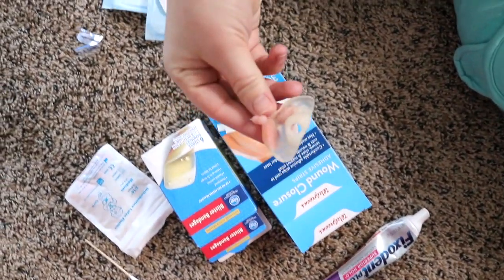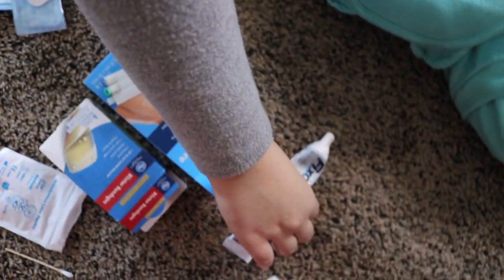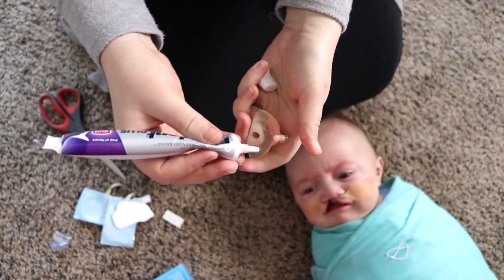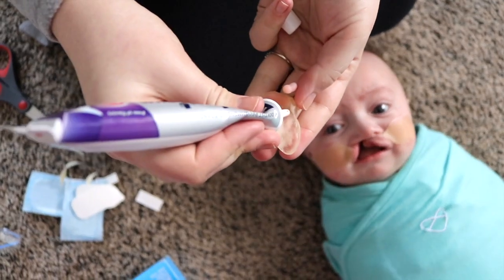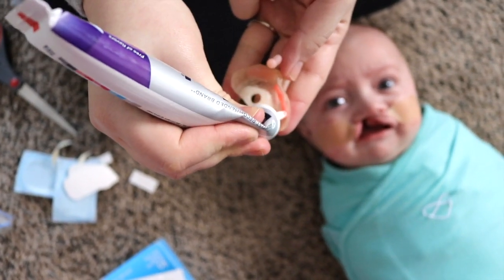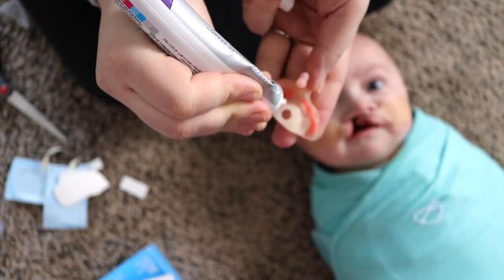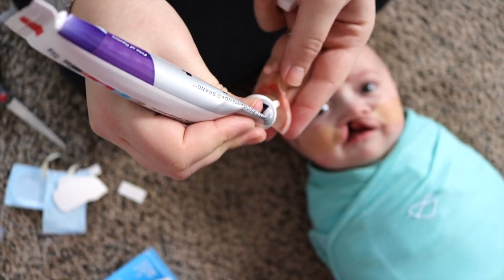I peel off the back and place it on one side of his face. I want to get that tape as close as I can to his lip without going in his mouth, and I make sure to smooth it down really well. His cheeks get really sore from all the taping, so it kind of hurts when we push down on the tape. These base tapes help it not be as bad as it would be if we were redoing the tapes every day. Next I grab the NAM and put some denture glue on it — just making strips of glue on each side where his gum pads are going to go, with an extra strip on the inside to make sure it really holds.